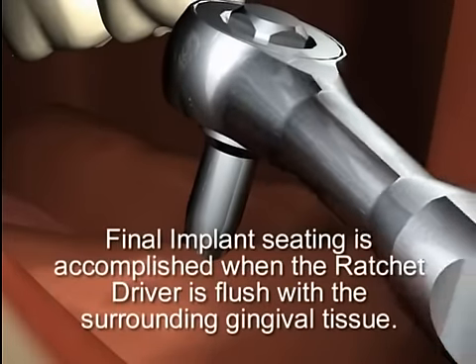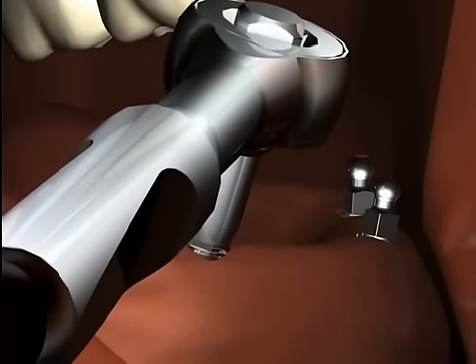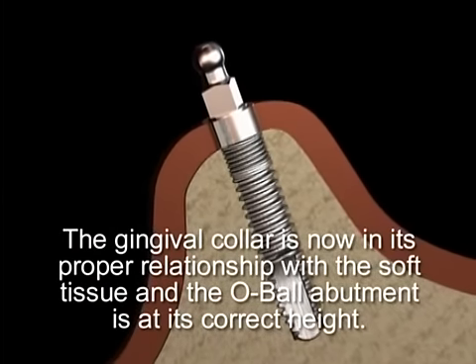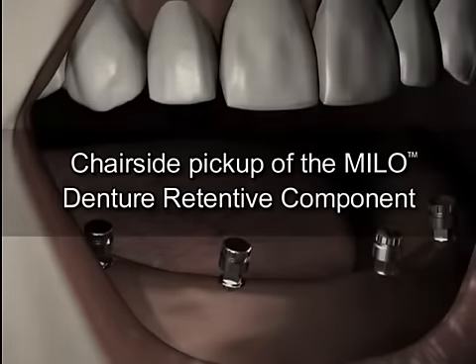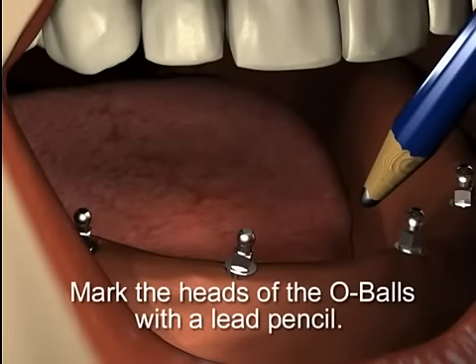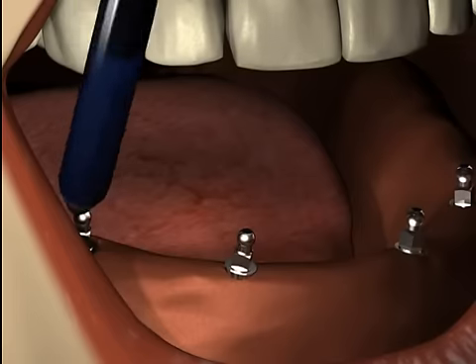Final implant seating is accomplished when either the ratchet driver or the contra-angle driver is flush with the surrounding gingival tissue. At this point, the implant is securely in place. The gingival collar is in its proper relationship with the soft tissue, and the O-ball abutment is at its correct height. For chairside pickup of the denture retentive component, transfer the position of the O-balls to the tissue-bearing surface of the denture by marking the heads of the O-balls with a lead pencil, or insert soft silicone or soft wax inside the denture.